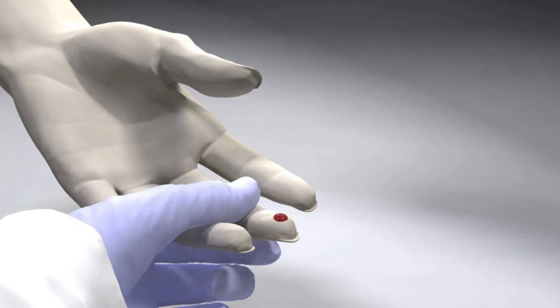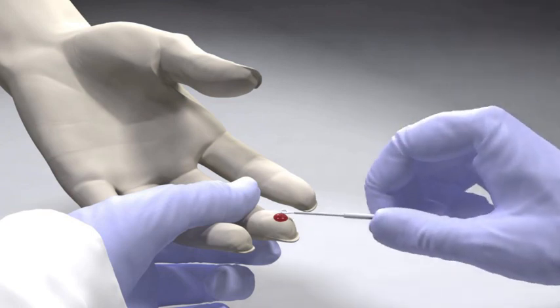If you're taking a sample from a fingertip, wipe away the first drop of blood after pricking the finger and sample from the second drop. Touch the tip of the 5 microliter sampling loop to the drop of blood until the loop is filled with blood.